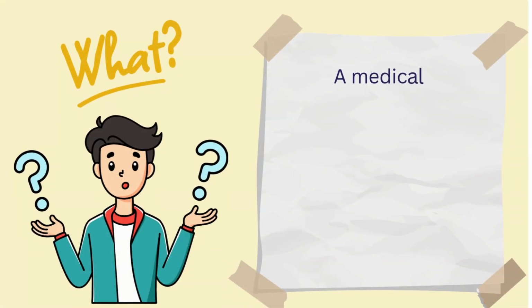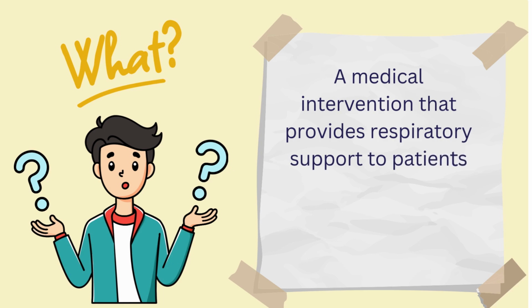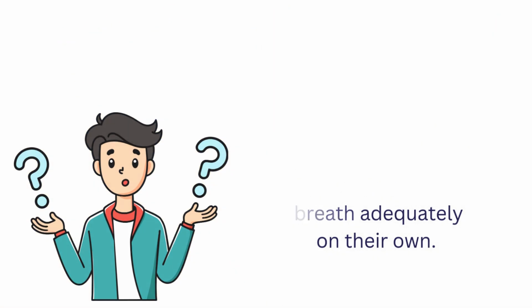What is mechanical ventilation? A mechanical ventilator is a life-saving machine used to help patients breathe when they're unable to do so on their own. It pushes air, sometimes with extra oxygen, into the lungs and helps remove carbon dioxide. This is vital in surgeries, critical care, or during conditions like COVID-19, pneumonia, or respiratory failure.